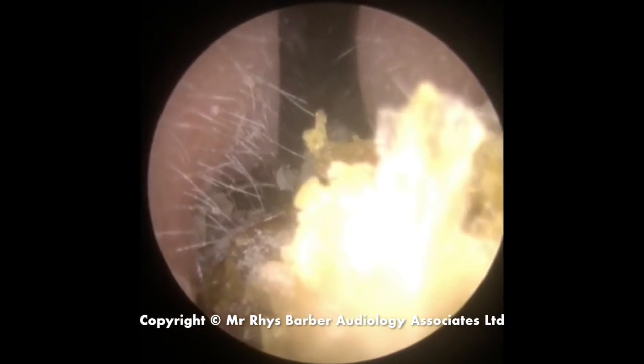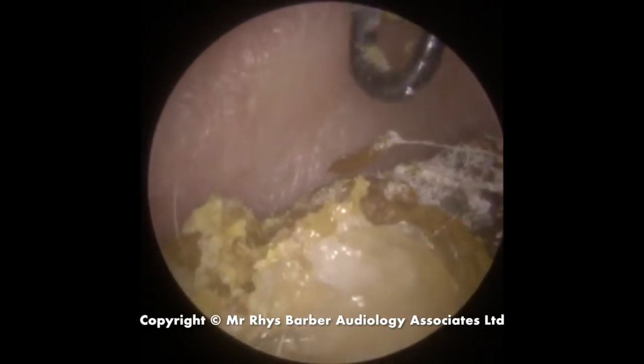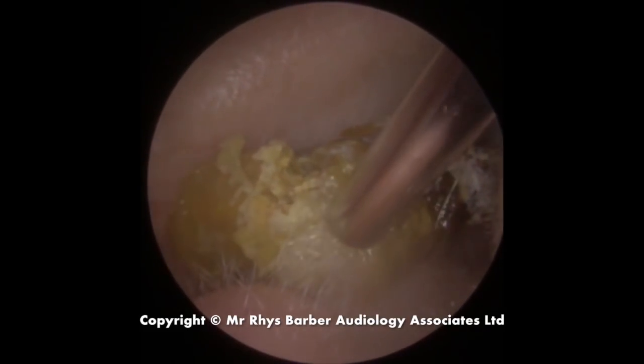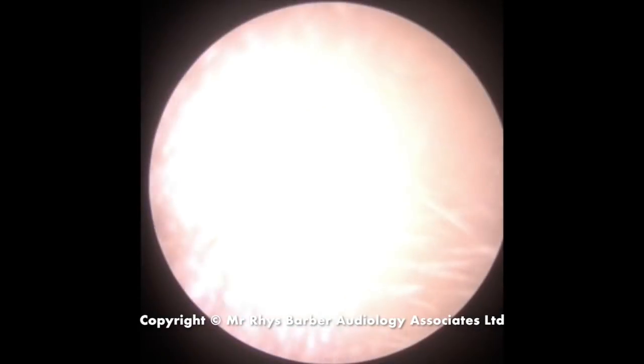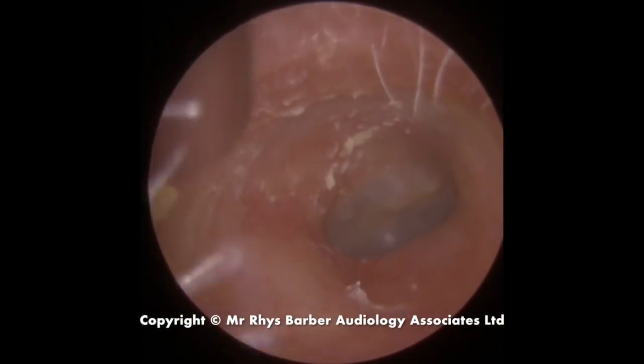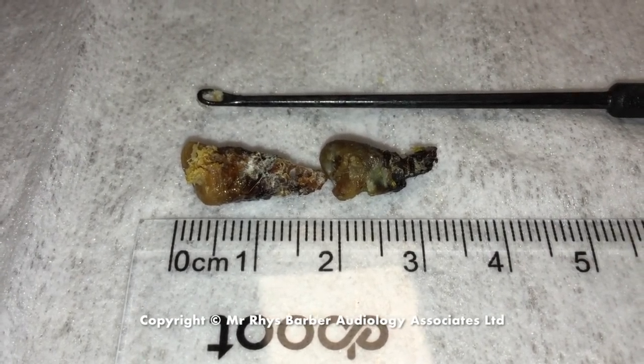You can see it's starting to come away now. There we go — you can see a little bit of white skin there at the back. Quite a large plug as well. A bit of dry skin there to the left-hand side — just take it away — and the eardrum looks nice and healthy.